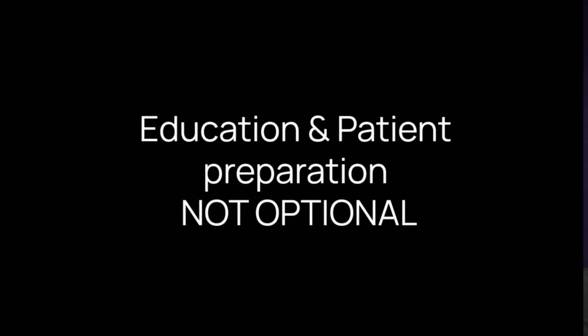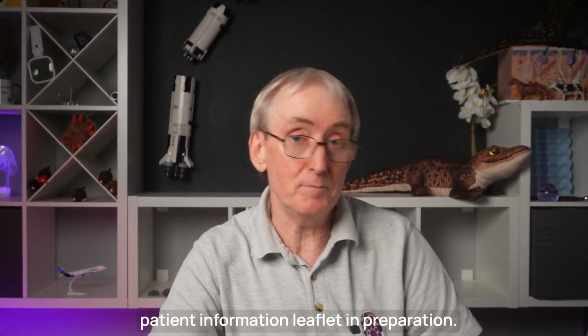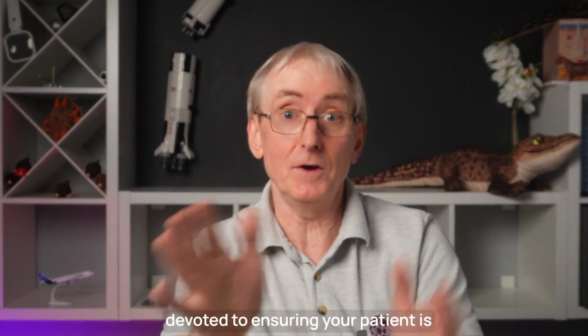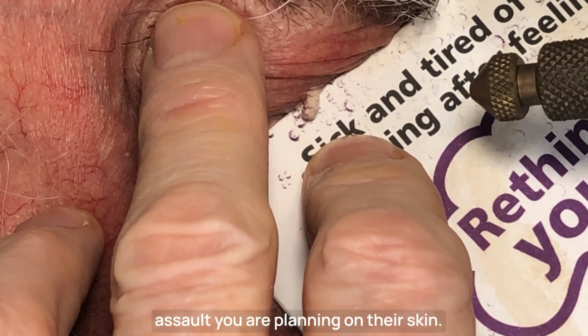Step 3. Patient education and preparation is not optional. As soon as you start thinking about using cryotherapy, start printing the patient information leaflet in preparation. Cryotherapy only takes 1 minute or so to apply. Spend at least 5 times that amount devoted to ensuring your patient is happy for you to hurt them and fully understand the consequences of the assault you are planning on their skin.